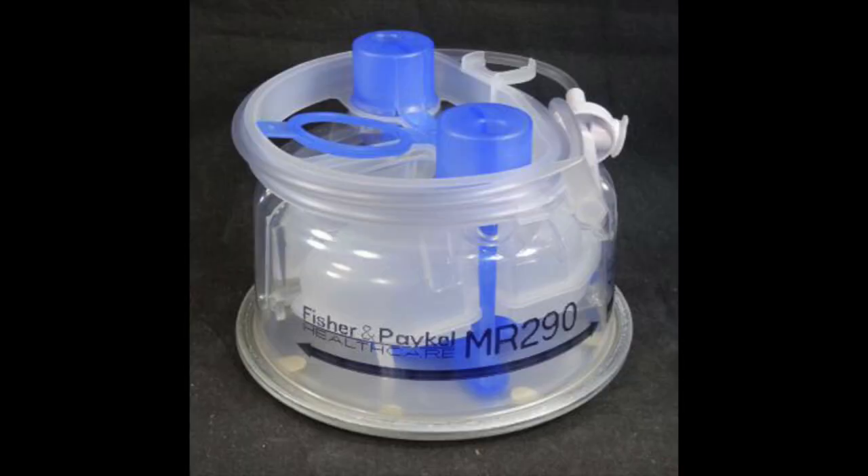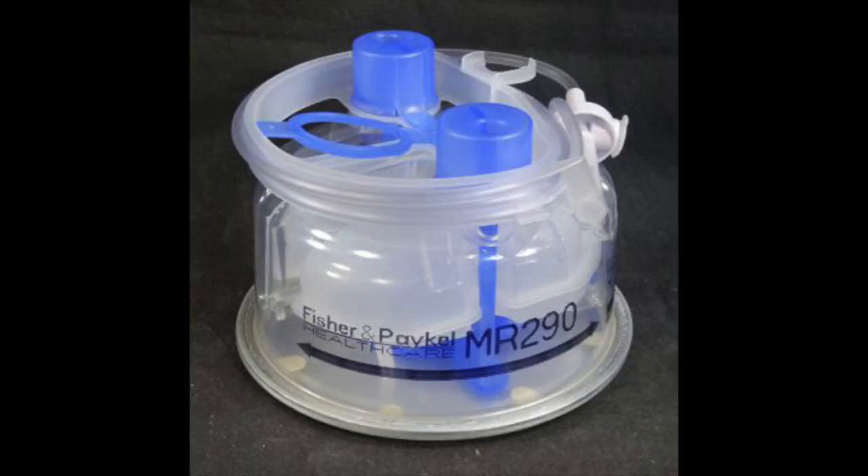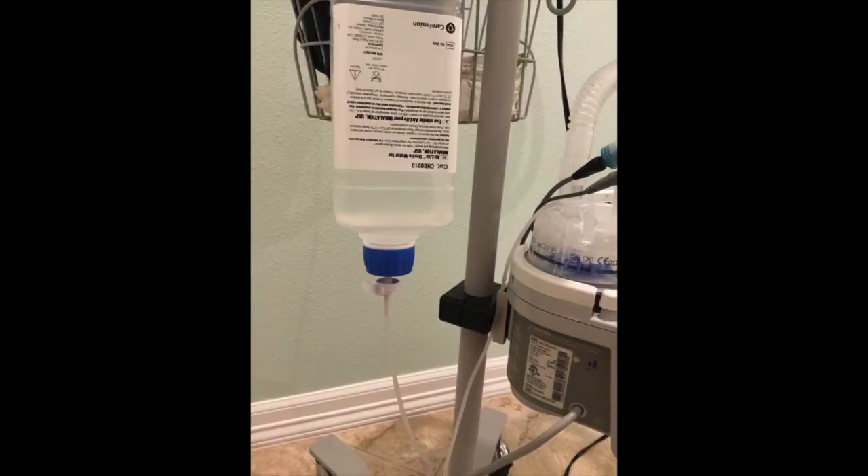Another option is to get a water chamber with an IV spike. The IV line from the water chamber will be connected to a 1-liter bottle of sterile water. If I fill up the 1-liter bottle, it will last about 20 to 22 hours. I'm able to get these water chambers online and occasionally from my durable medical equipment company. However, these bottles of sterile water are very hard to get — I often get them whenever I'm in the hospital. Since I only have a few of these bottles, I wash them out frequently and refill them with distilled water, reusing them until the seal on the bottle cap breaks.